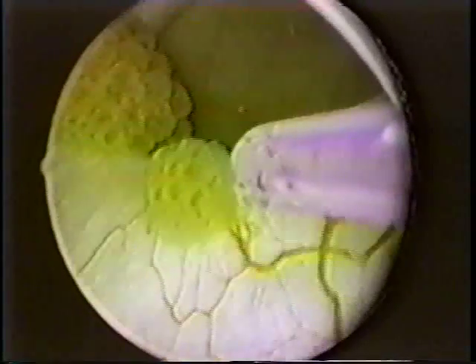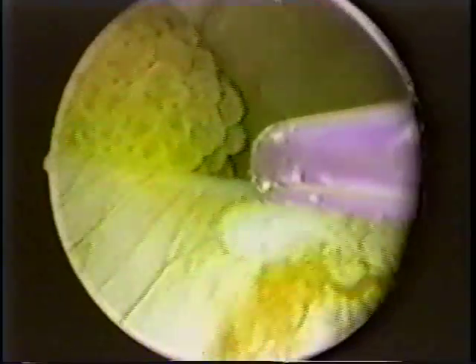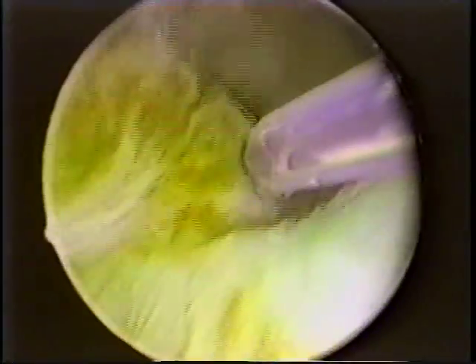In this video, there are two tumors located on the edge of a bladder diverticulum. These tumors would be very difficult to deal with if an attempt was made to resect them with the standard electrocautery.